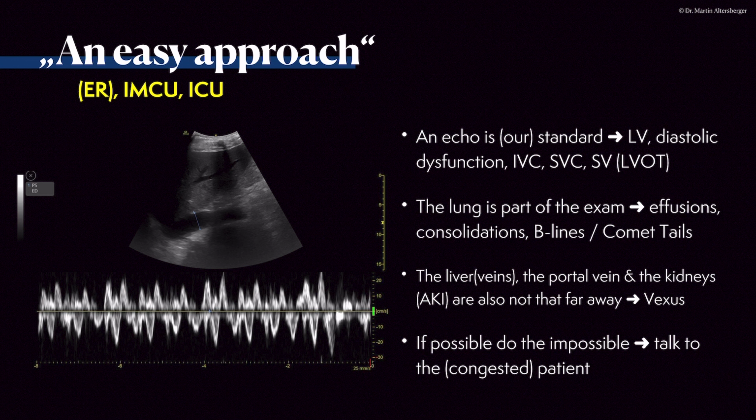So the clinical status of the patient, the clinical findings, the history is very important. So if it is possible, if the patient is not intubated, talk to your patient and figure out with the clinical findings and your ultrasound if the patient in this case is congested or needs volume.